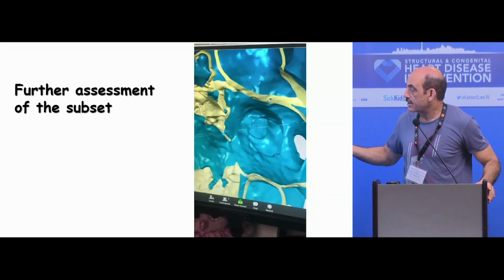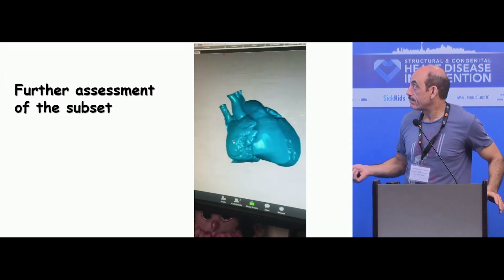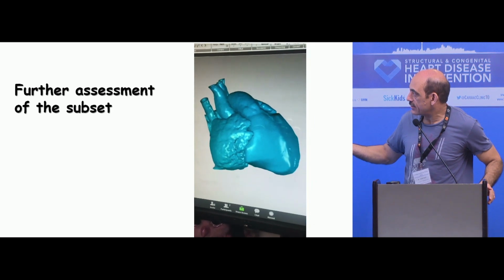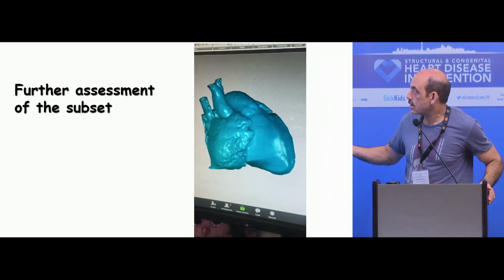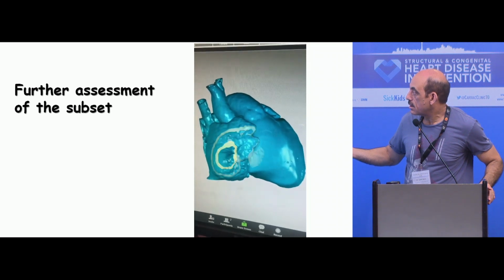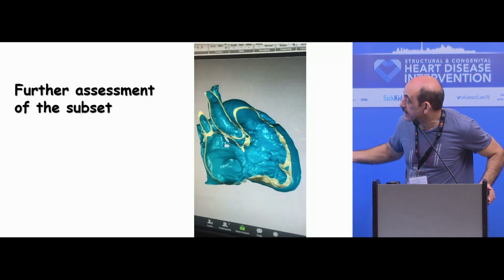So I had a very hard time, and by TEE I was never happy. I did not know this anatomy at that time. Now if you go to the right atrial side, actually it becomes even clearer. You see, it becomes clearer here.